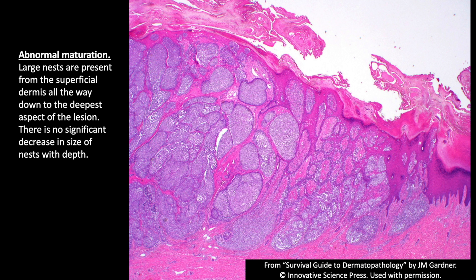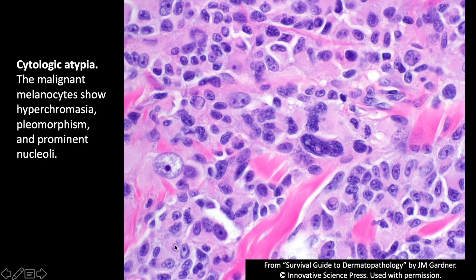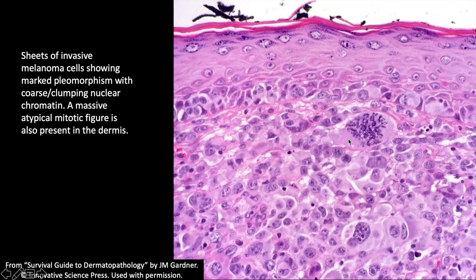Obviously, if we see big, ugly atypical cells we're very concerned for melanoma, or if I see dermal mitoses — particularly large, atypical ones like this. These are all very dramatic examples; in real life it can be a lot more nuanced and subtle. I still struggle with difficult melanocytic lesions basically every day of my practice, even after nine years as a board-certified dermatopathologist. Most dermatopaths would agree — melanocytic lesions can be very challenging.